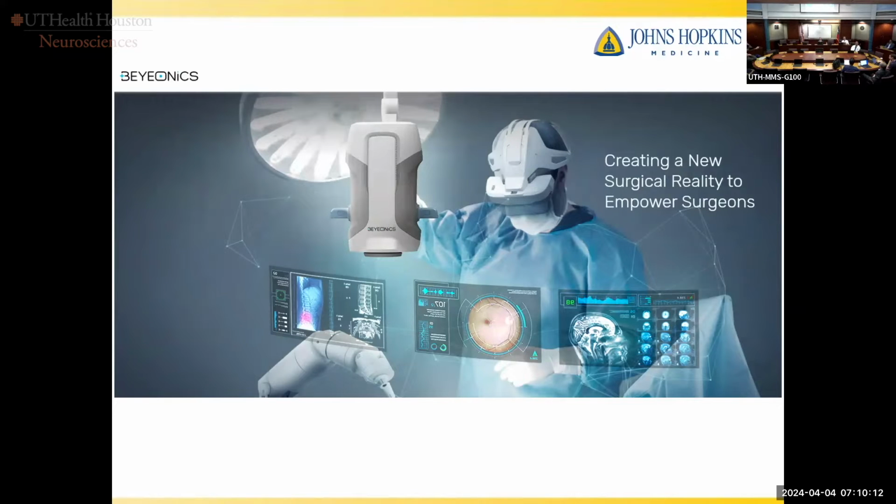And I don't know if any of you have used the exoscope. We actually bought one, and I've got to tell you, it's a little bit finicky to use at first. And for people that are sort of used to using the microscope, sometimes it's a little bit tough. But there's a remote screen, and you have this exoscope that kind of sits in the middle of the field, and it gets sometimes cumbersome to actually look around, either the person opposite you, to see these screens. But what this company decided to do was take this similar concept with an exoscope and then link it to an augmented reality headset.